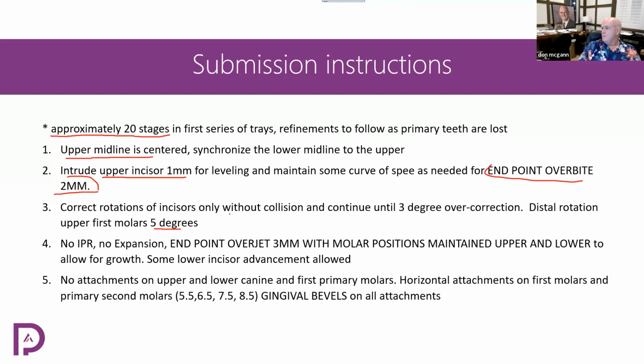But they know what to do, to distal rotate around the palatal root. Wait a minute. Is this simulation available with a scanner? This particular one, which is only for consultation purposes, is a MEDIT simulation that they have existing. Ours, we looked at that and said they've already got at least a portion of what we want to do.